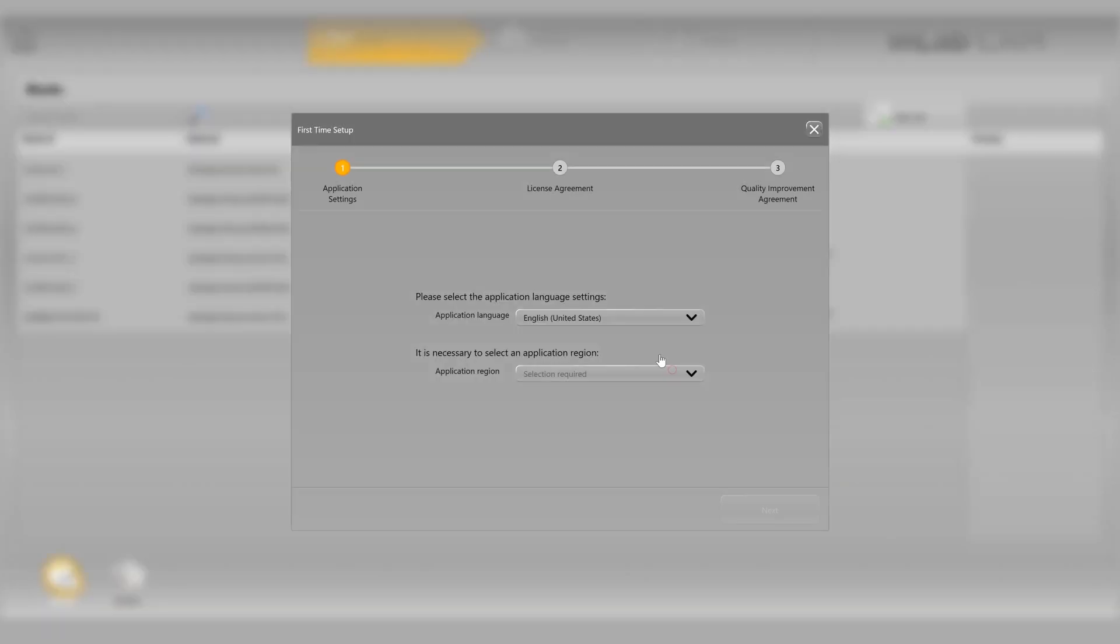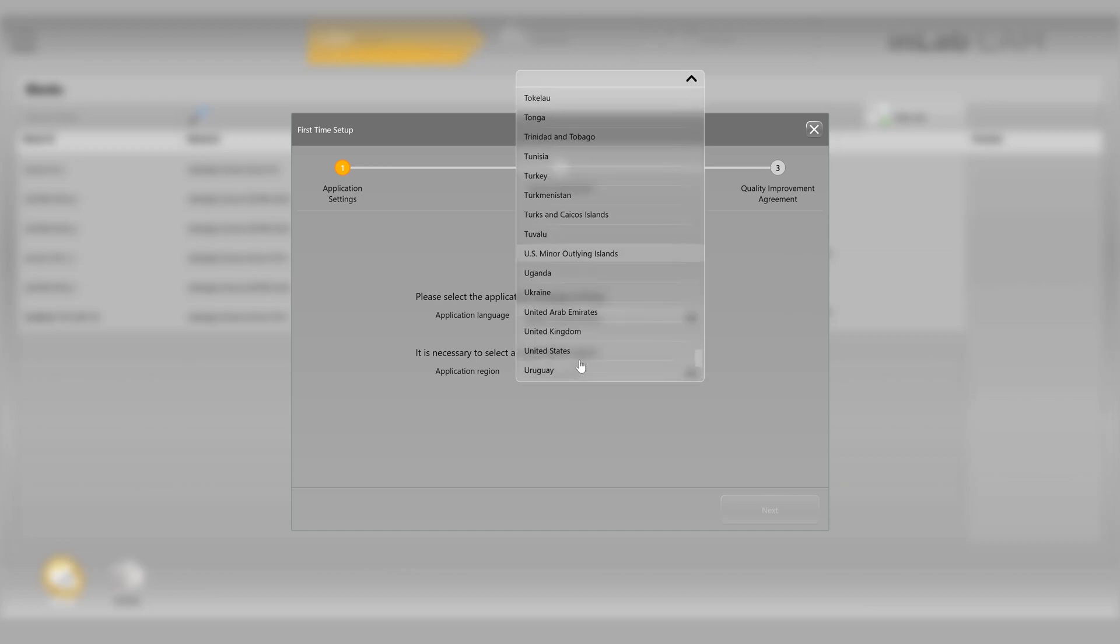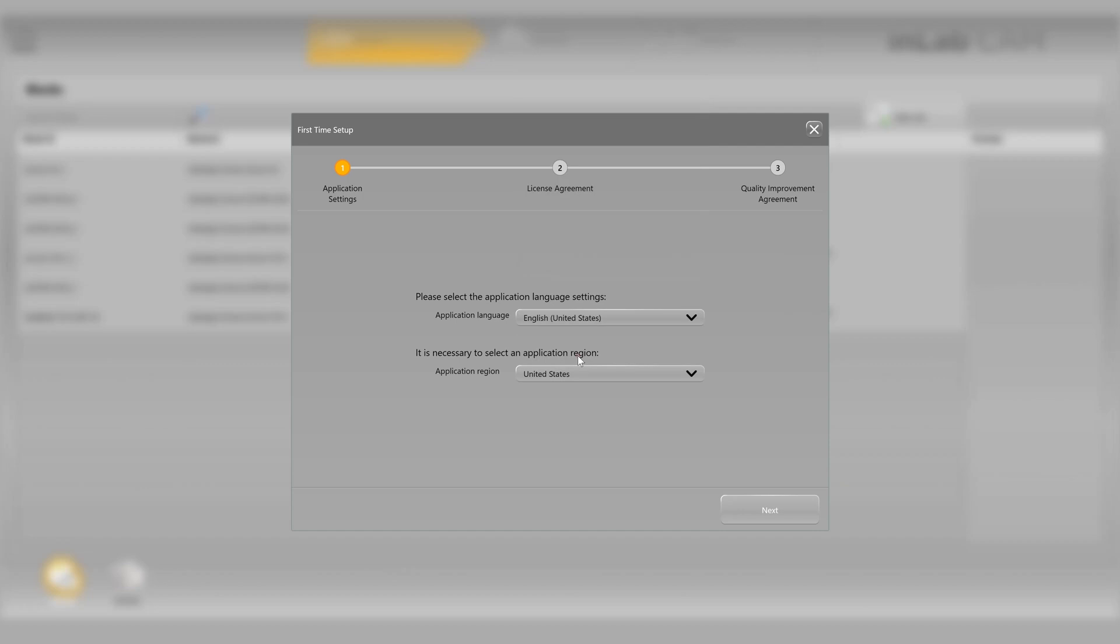Now we'll be prompted to select our application region. In our case, it will be United States, so go ahead and navigate to that. Select United States and then next.